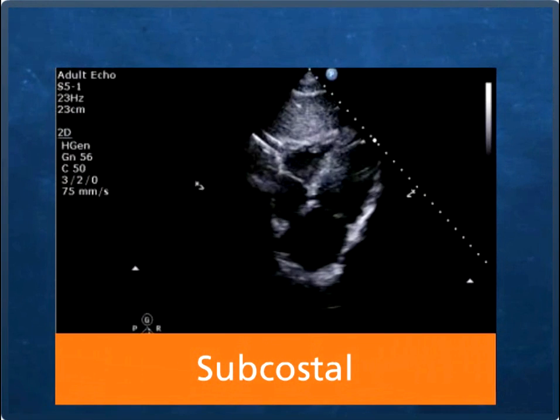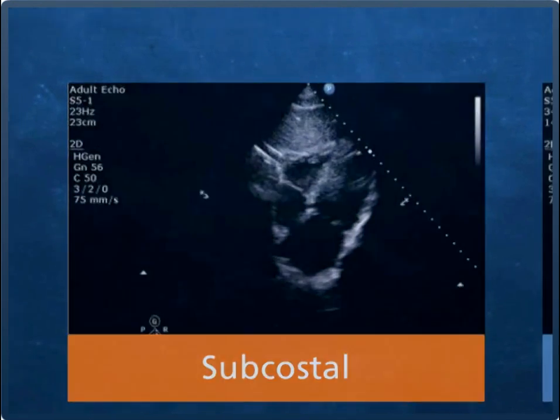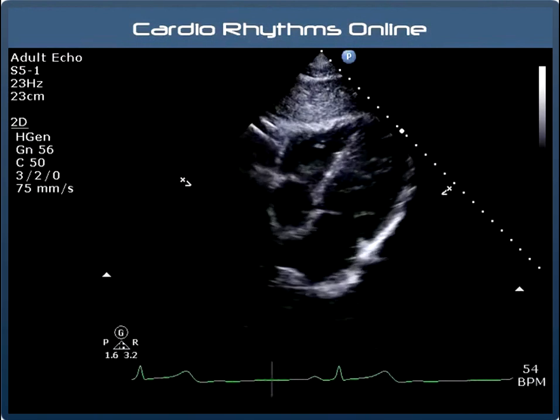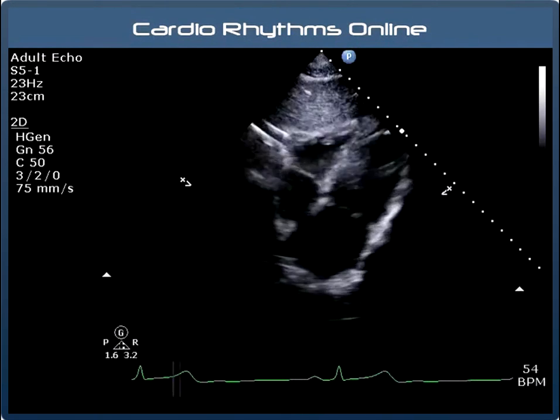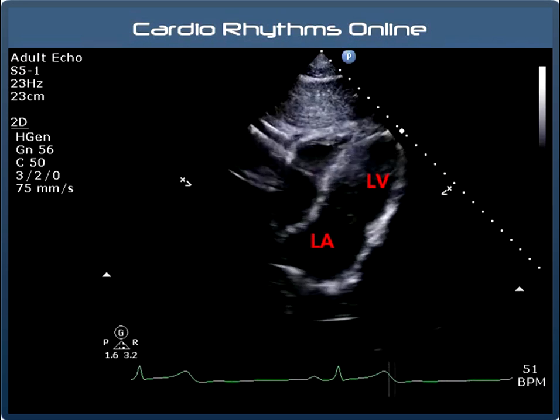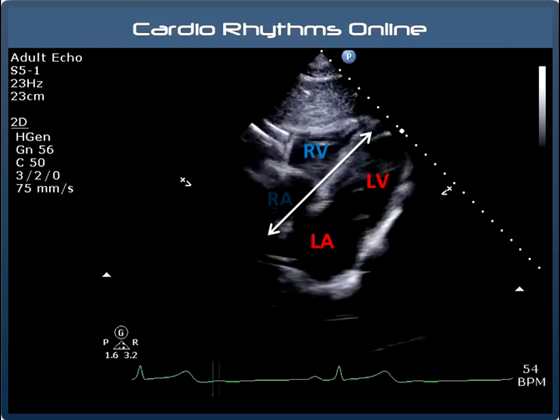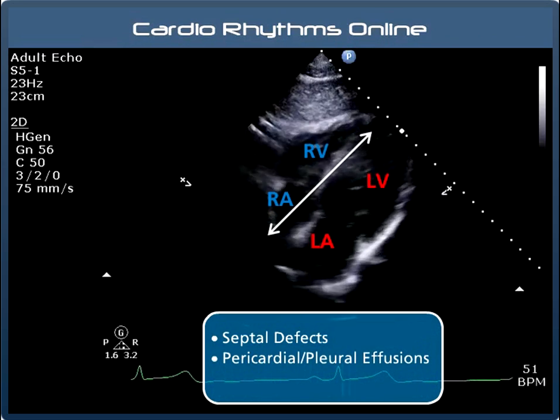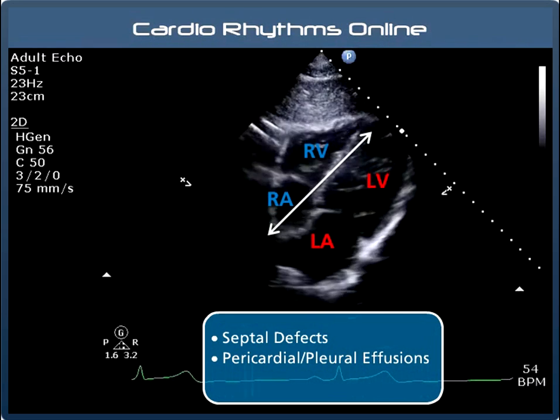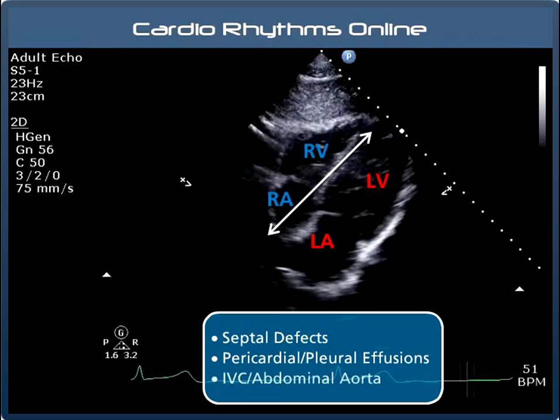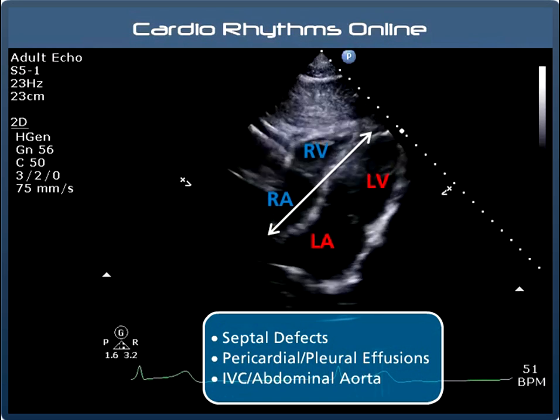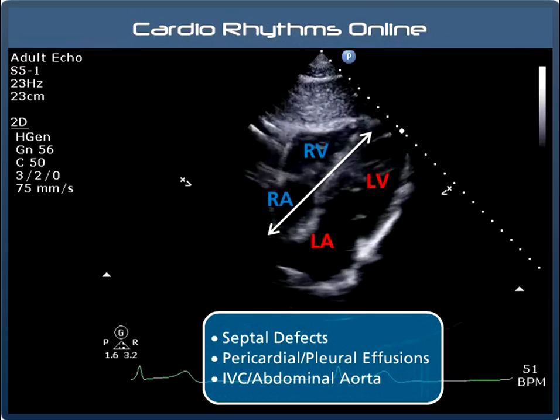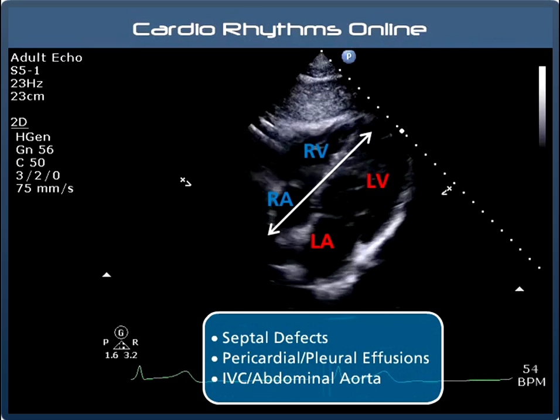With this subcostal view the patient lays on their back and the transducer is placed below the sternum and angled upwards toward the heart. This kind of looks like a four chamber view on its side. Ideally the septum should now be perpendicular to the transducer, which is great for picking up septal defects using colour flow Doppler. Here we have the left ventricle, left atrium, septum, right ventricle and right atrium. Aside from septal defects, this is also a good view for visualising pericardial and pleural effusions. By rotating the transducer anti-clockwise we can also bring in structures such as the IVC and the abdominal aorta. If you work in emergency care or have someone with a misshapen ribcage, a subcostal view may be the only view you can obtain, so we often use it as a modified alternative to the standard parasternal and apical views for assessing structure and function.